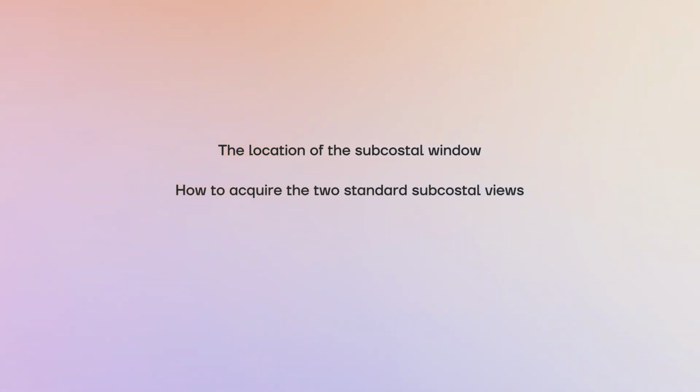In this video, we covered the location of the subcostal window, how to acquire the two standard subcostal views, and practical tips to improve image quality. By mastering these techniques, you will be able to consistently and reliably acquire subcostal images.